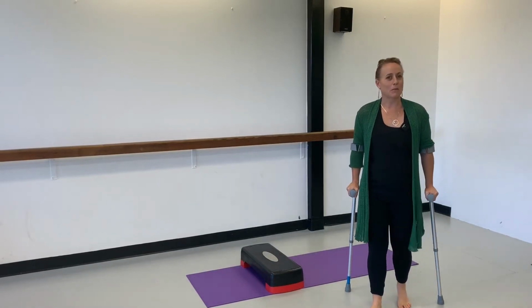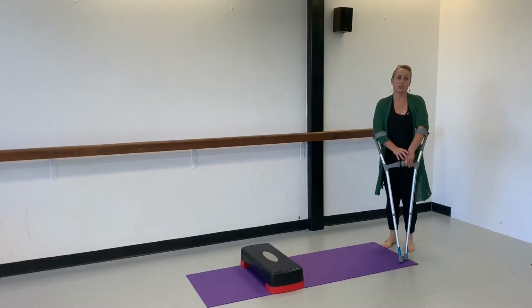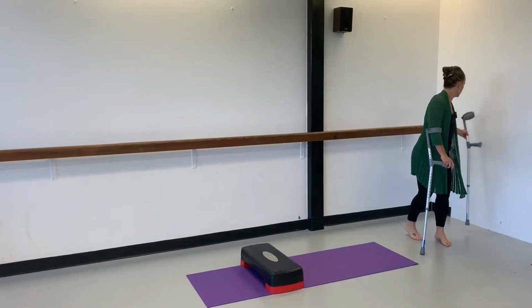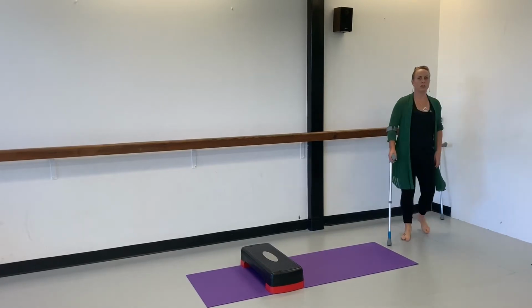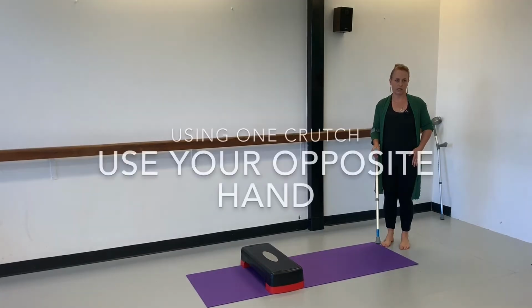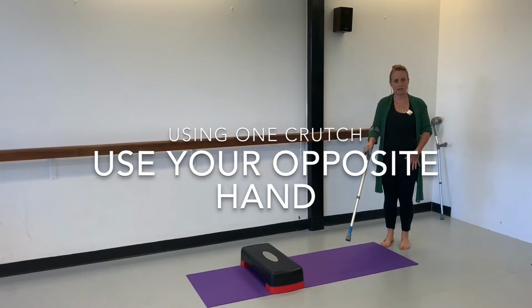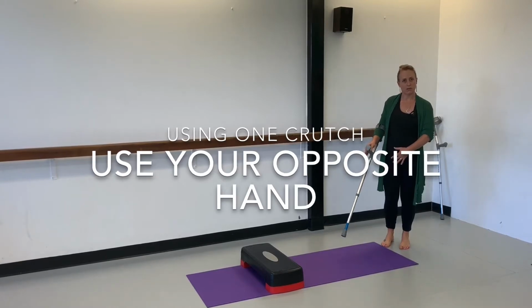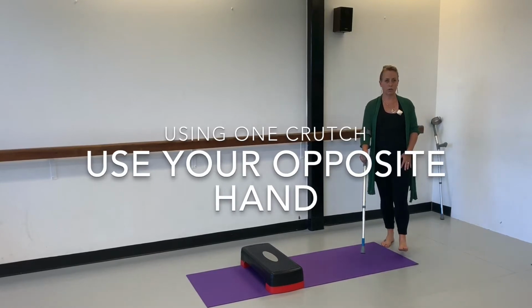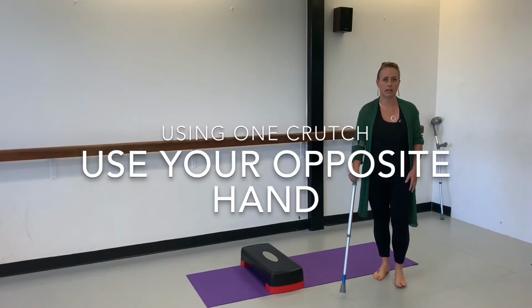As you become more efficient at that and as your pain levels drop, you can go down to 1 crutch. So with 1 crutch, you will make sure that you use your crutch on the opposite side of your affected hip. So if you've got a left hip replacement, you'll use the crutch in the right hand. If you've had a right hip replacement, you'll use the crutch in your left hand. You'll take your sore leg forward or your affected leg forward and take the crutch together at the same time and then step the other leg through.